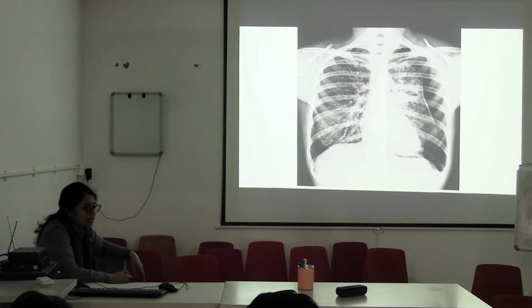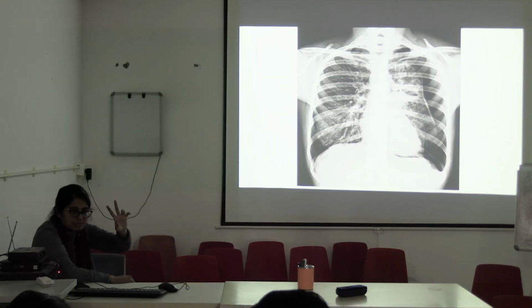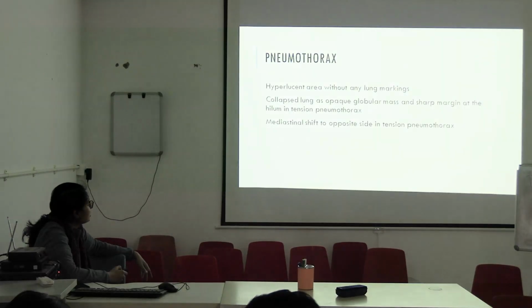Okay, mediastinum shift dekhte gele two things you will have to see. Let's go back to the slide.